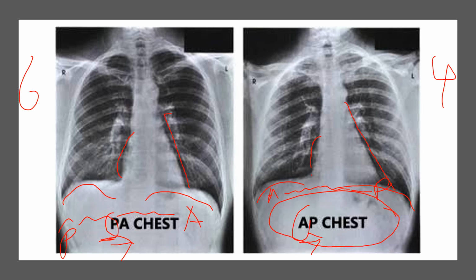If we're looking for masses or nodules or lung inflation or things like that, if you have a patient that's an emphysema patient and they just want to go in and get an x-ray done, and they're healthy otherwise, in other words, they're not in the hospital, then a PA is going to be a lot more valuable than an AP, because then you can see what their full lung expansion is, if they're hyperinflated or not, or if there's nodules, especially in the upper lobes, that we've got to be worried about. So that's something just to pay attention to.